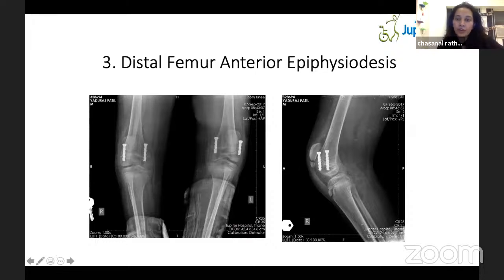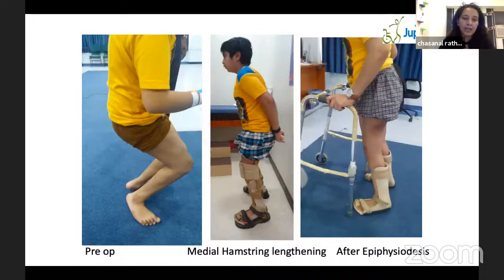So if we look at preoperatively, because of constant knee flexion deformity, there is an avulsion fracture of the tibial tuberosity as well as stress fractures at the patella. So these gait patterns cause a lot of stress on the joints, apart from changing the ground reaction forces, or the forces across our body, and that's how they're energy consuming gait patterns. And this knee flexion is so bad that it is capable of causing these kinds of pathological fractures as well. So this was the child preoperatively.